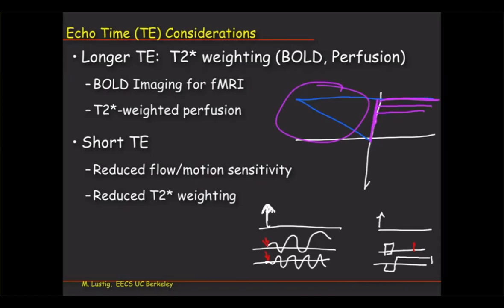That is sometimes an issue though, because to be honest, the image is not completely real. So what people actually do is they move a little bit that way and collect, and then move a little bit and collect. And so they get a little bit of the left side such that they can estimate some phase and then correct for that slow changing phase. And this is called a partial readout echo, right?